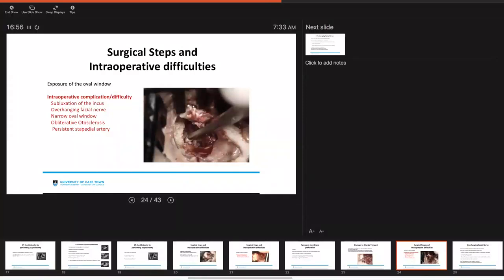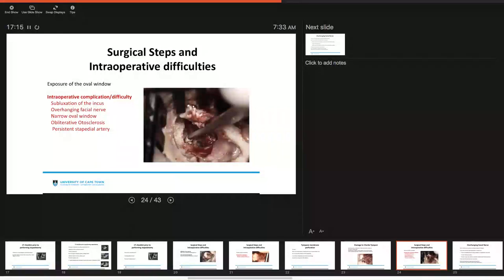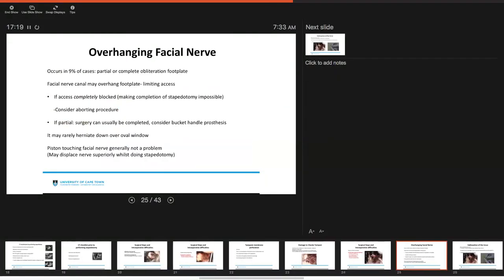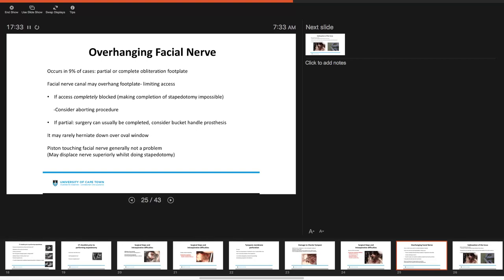You then want to subsequently try to expose, get good exposure of the oval window. The intraoperative complications or difficulties you may experience at this point is subluxation of the incus. You may encounter an overhanging facial nerve. You may now see that you have a very narrow oval window. You could discover that you have an obliterative otosclerosis or you may note persistent stapedial artery. With an overhanging facial nerve this occurs in around nine percent of cases and can cause partial or complete obliteration of the foot plate.